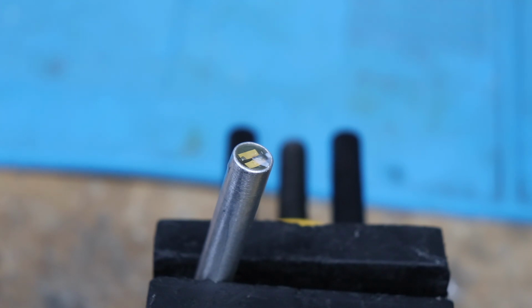And the vascular probes do go up. I've got a machine here which goes up to about 9.4, 9.6 megs. So generally, the higher the frequency, the more superficial the vessels the probe tends to be used for. Other than that, there's not much to it. It basically has two coax cables with a couple of phono connectors on it, which plug into the Doppler machine, and that's it.